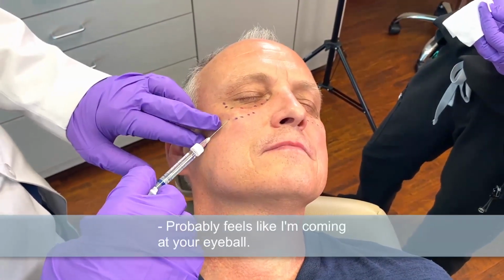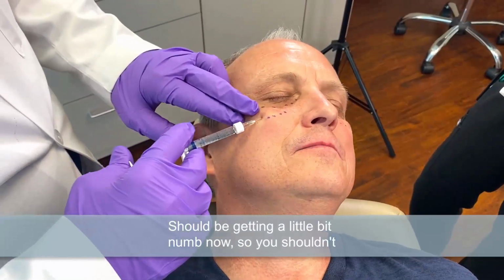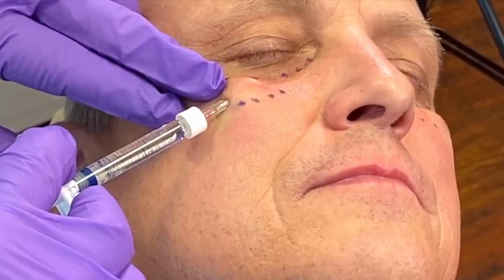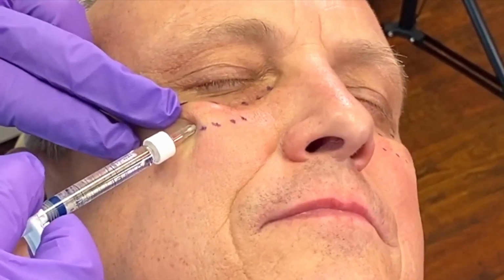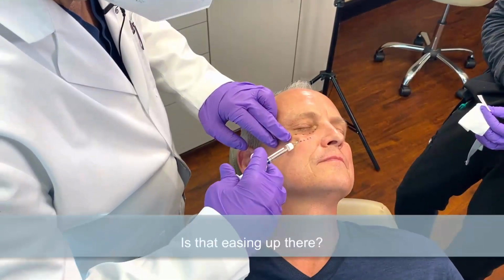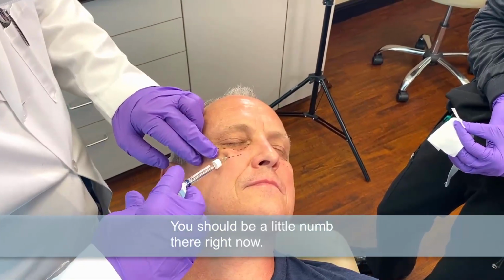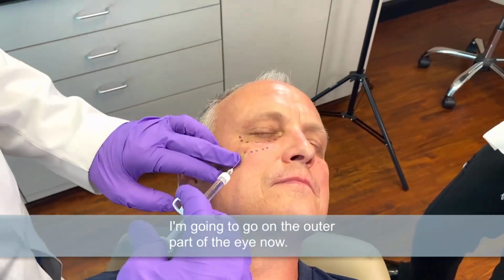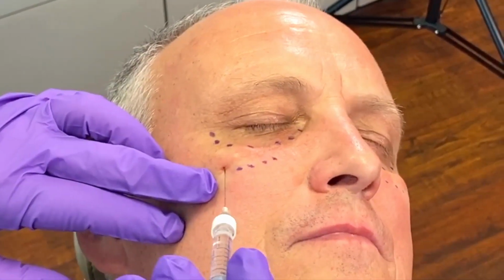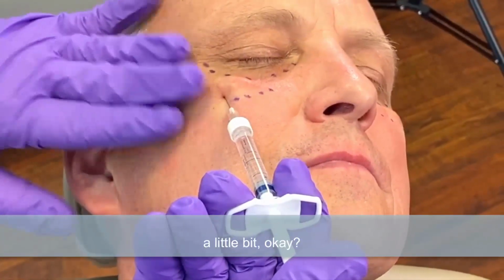Probably feels like I'm coming at your eyeball. I promise I'm not. Should be getting a little bit numb now, so you shouldn't really feel as much. That easing up there? Should be a little numb there right now. I'm going to go on the outer part of the eye now. This feels weird, so hang in there with me. I'm tapping on you a little bit, okay?